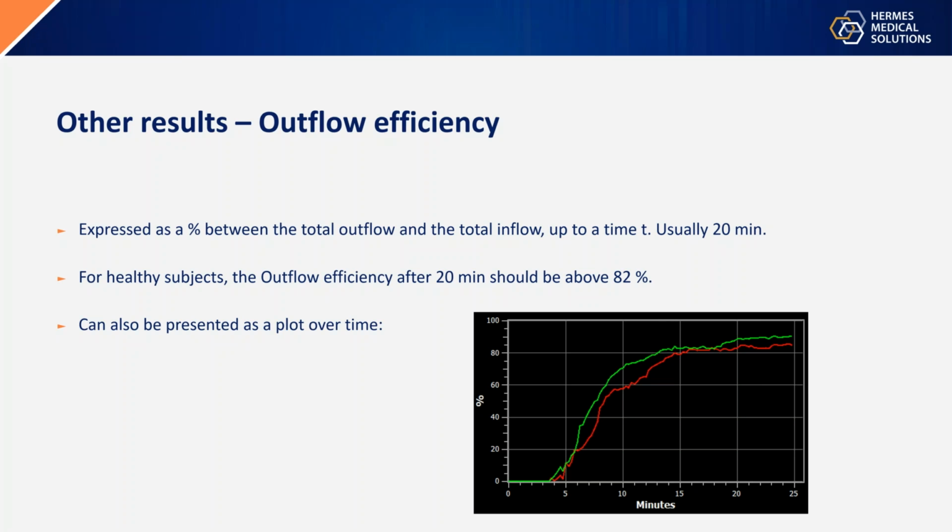The outflow efficiency is most commonly used when the renographic response from furosemide is ambivalent or not as clearly visible, perhaps due to poor renal function or a gross pelvic dilation. Many times this is then solved by simply letting the patient rest for a while and taking a late image. But if this too is ambivalent, or due to time constraints, the outflow efficiency can then be an alternative or an addition to acquiring a late image.